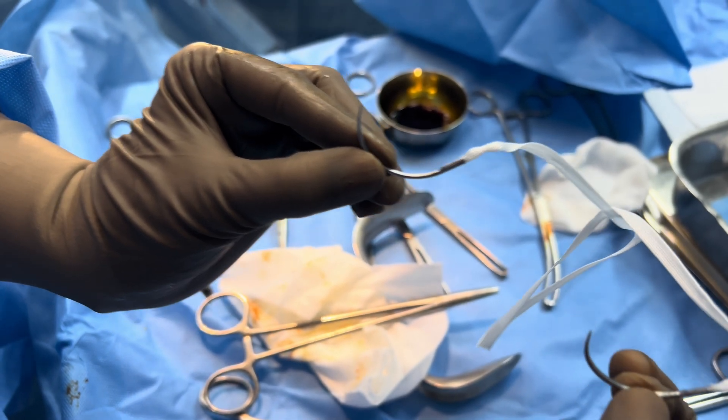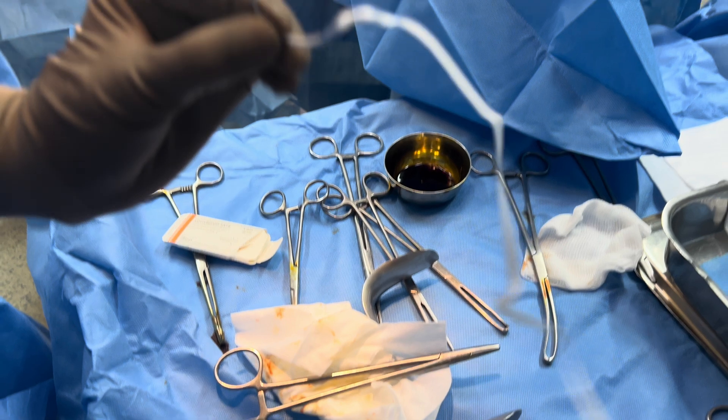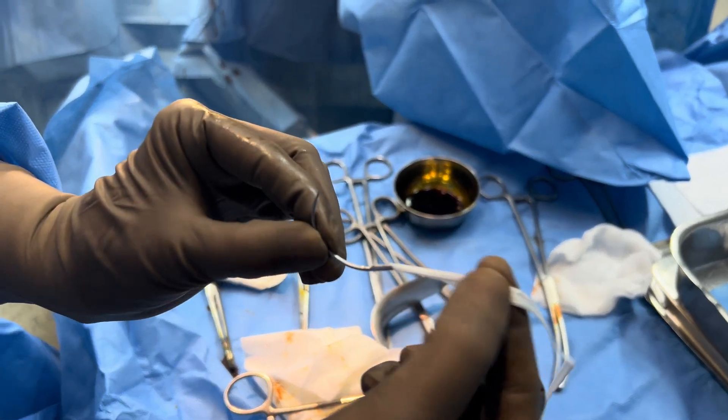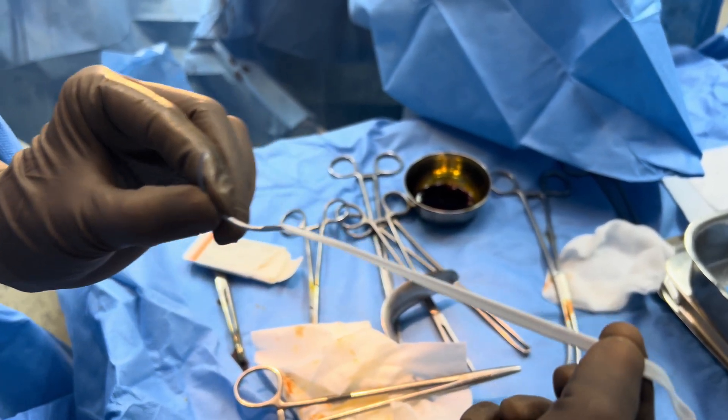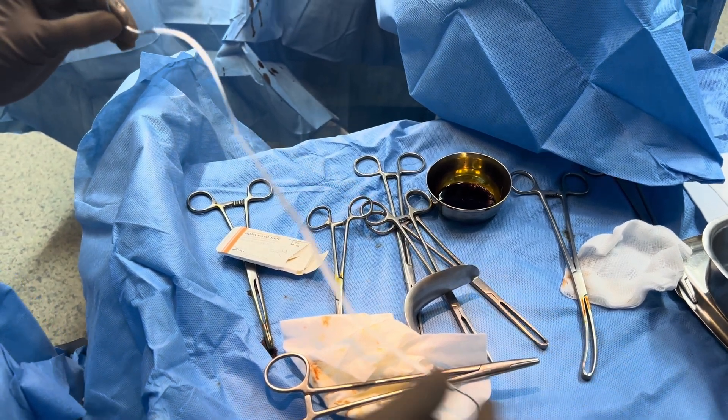This helps in better knotting security, and it also helps in ease of the procedure. The outcomes are also better with this tape, as I have seen.